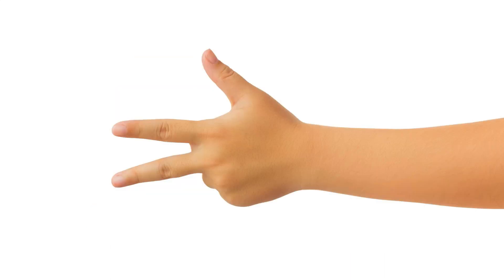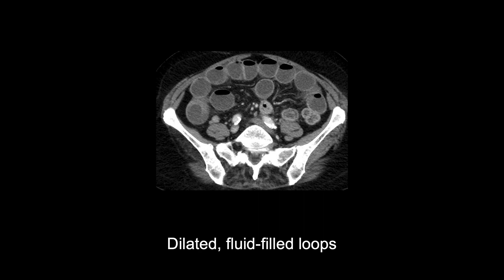Let's start with the diagnosis of a typical small bowel obstruction caused by adhesive disease. There are three key imaging findings that will help you make this diagnosis. First, the presence of dilated, fluid-filled loops of small bowel. The degree of dilation can vary based on the severity and acuity of the obstruction, but in general, when the small bowel loops measure greater than 2.5 to 3 centimeters, an obstruction becomes likely.